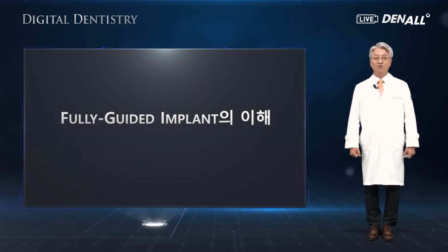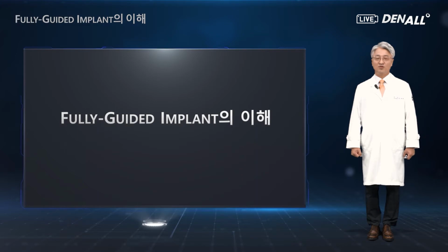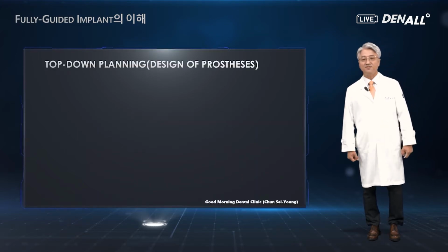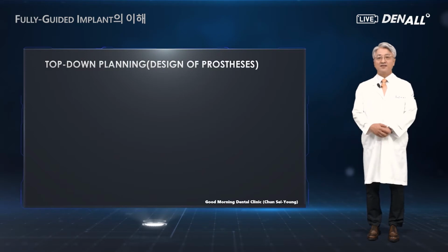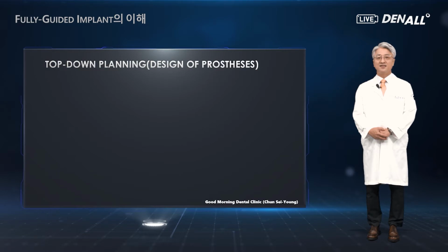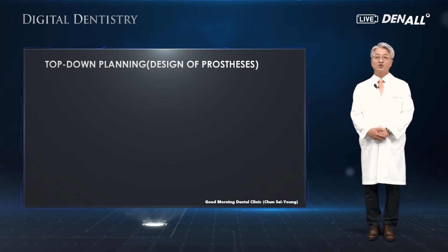This is the second lecture of digital dentistry, and this time I'm going to talk about the understanding of fully guided implant. Full guide implant, what is it? First, the full guide implant is characterized by the top-down implant planning.